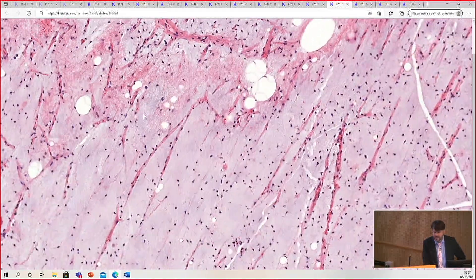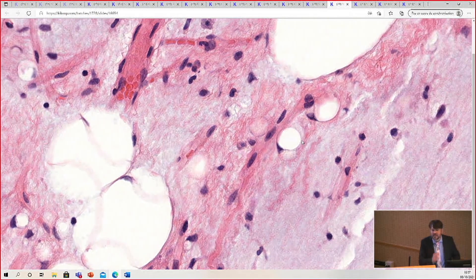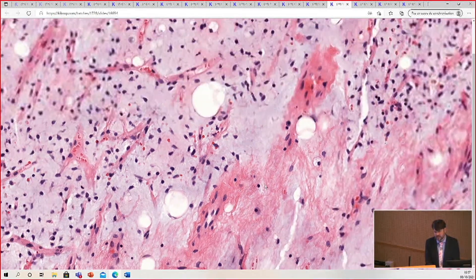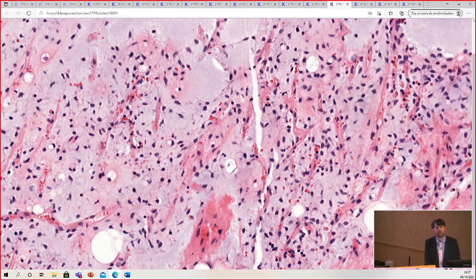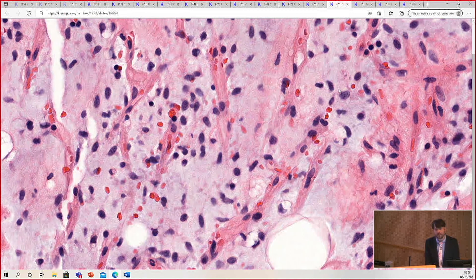You will see lipoblasts, but they'll be little tiny cute lipoblasts — little signet ring cells, or maybe bivacuolated lipoblasts — not the ugly pleomorphic lipoblasts you expect to see in pleomorphic liposarcoma. You will not see those. All the cells look the same, and why is that? Because it's a translocation sarcoma — all of the cells have the same abnormality, which is a fusion between the FUS gene and the DDIT3 gene, formerly called CHOP.